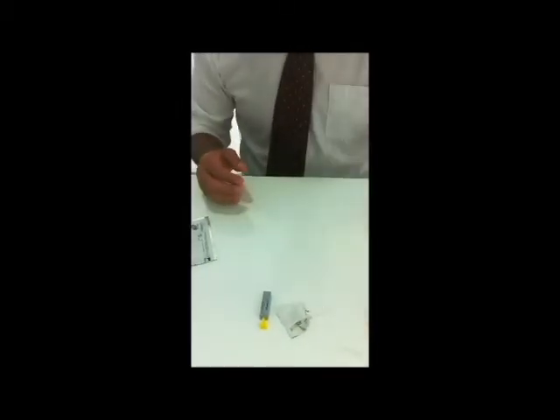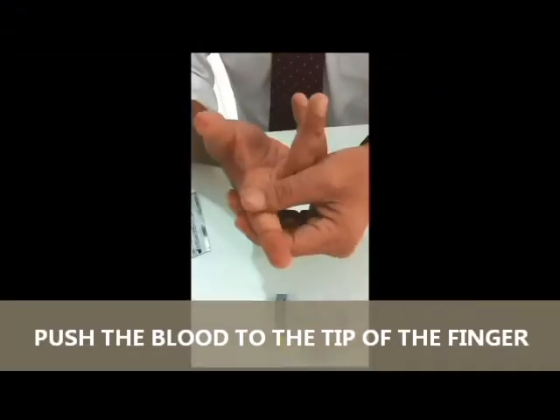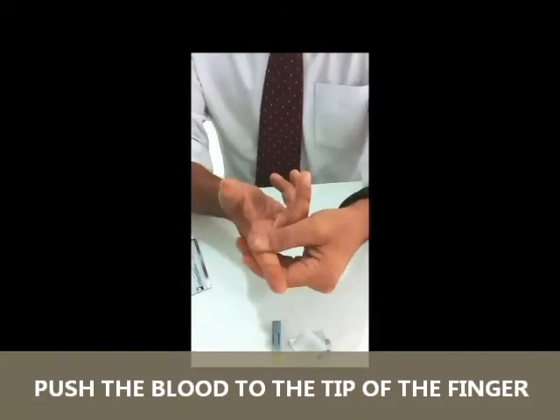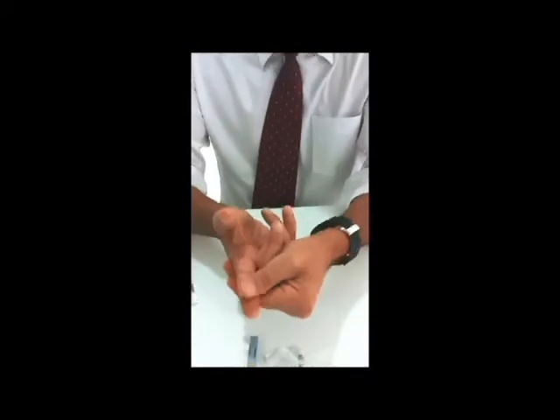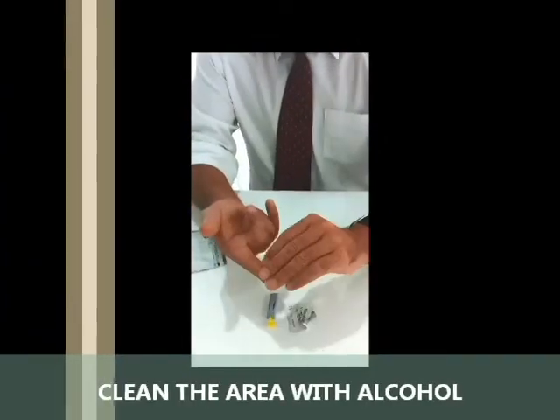How the test is performed: you choose the finger you're going to use, and you just roll some blood down towards the tip of the finger until you see the slight blood collecting in the capillaries. Then you take the alcohol swab, wipe the finger off, and sterilize it.